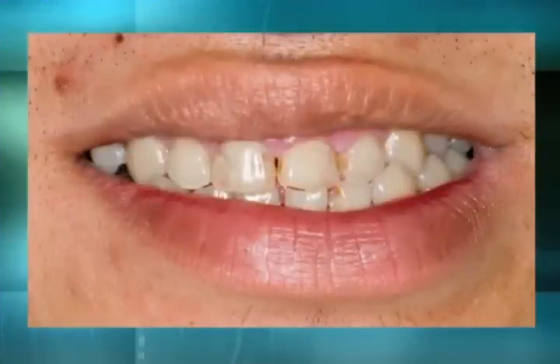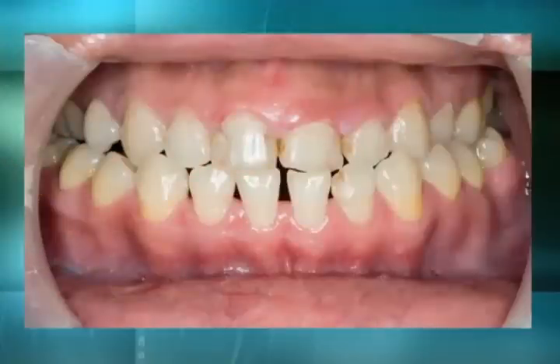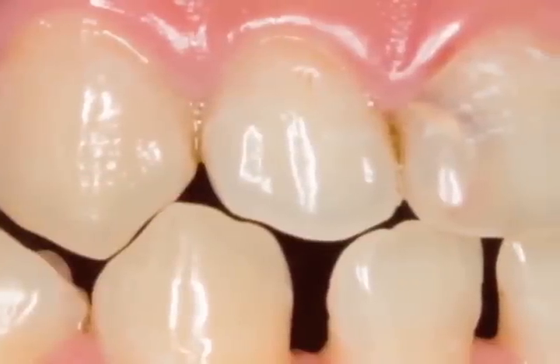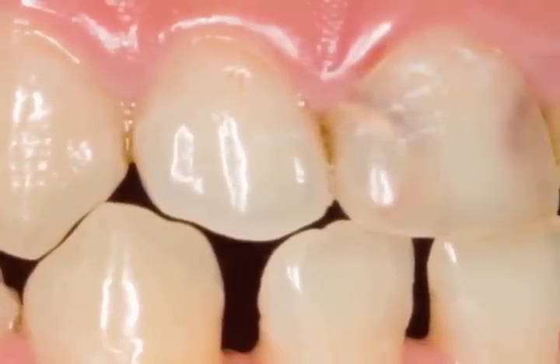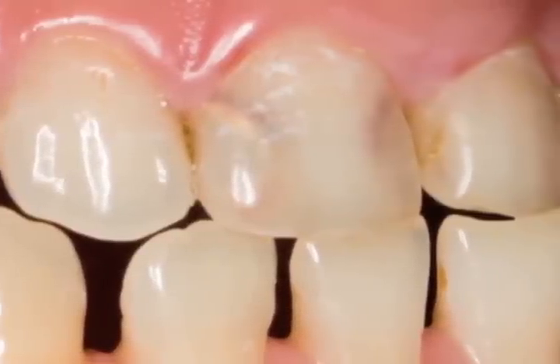Here's another clinical zirconia case. The patient has an anterior crossbite, some old composites including a very large composite on tooth number 8, and discrepancies in the gingival levels — all kinds of aesthetic issues that need to be solved. Because the patient has a history of recurrent decay on these teeth, we're going to use a cementable material like clinical zirconia.